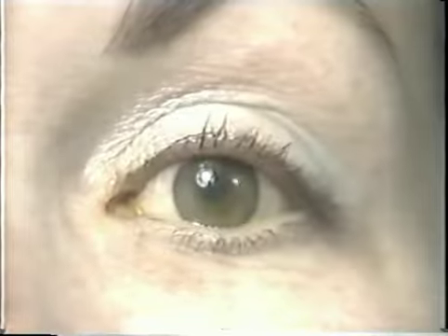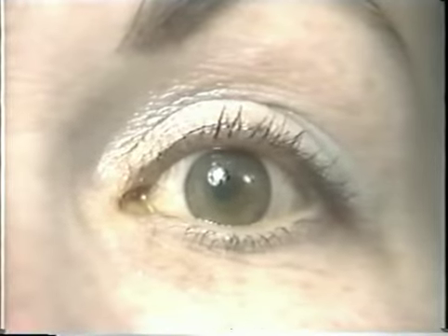If there is too little fluorescein, which may result from evaporation of the stained tear layer during protracted measurement or in a dry eye, the meniscus will be thin and intraocular pressure will be falsely low. The patient should be told to blink several times and the measurement repeated. If pulsatile movement of the mires is noted, the final adjustment should be halfway between the 2 extremes.